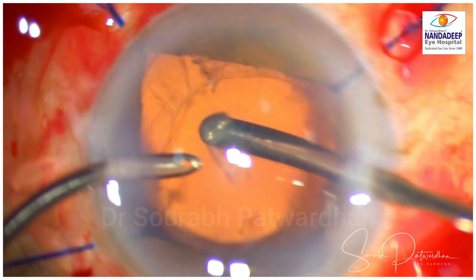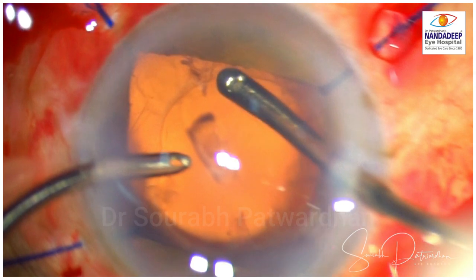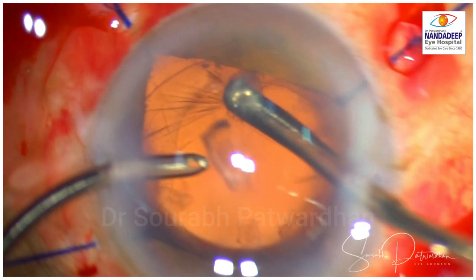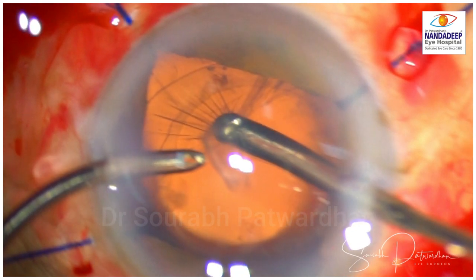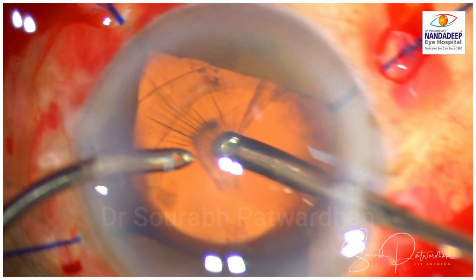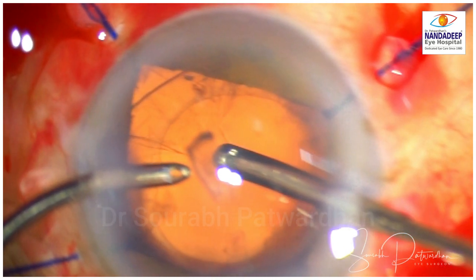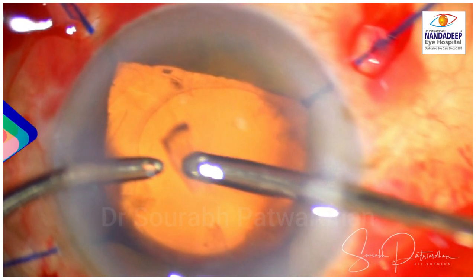Just watch this pattern — watch how the capsule folds, the radial striations which are created indicating that it is a posterior capsule, and there is posterior zonular loss there causing localized dialysis. So this is not cortex; it is a capsule being held, which was timely identified by the surgeon.